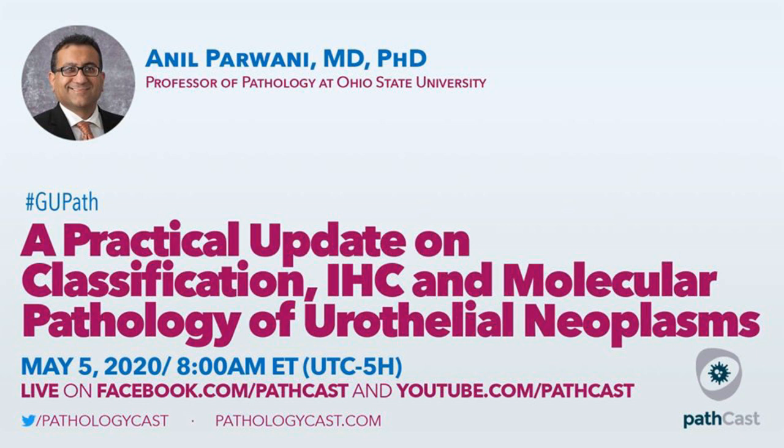But occasionally, when there are only 1 or 2 cells, you can do CD31 or a vascular marker and see, is this what you're calling a retraction artifact? Does it have any endothelial cells or not? I rarely use it in the context of a micropapillary variant.